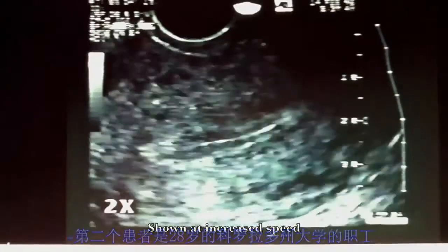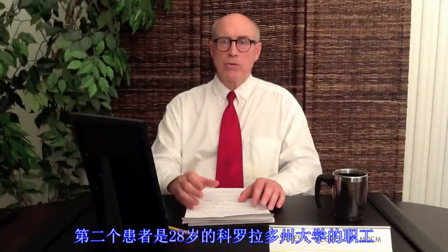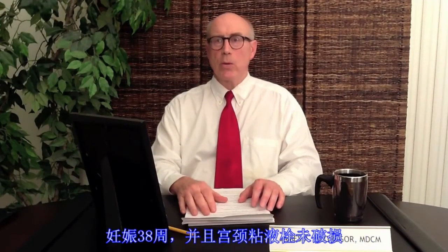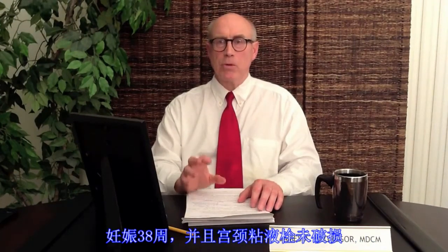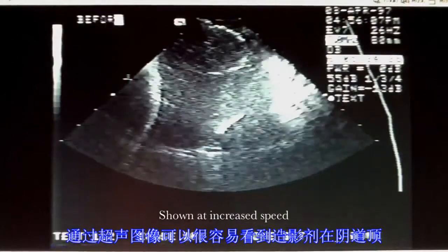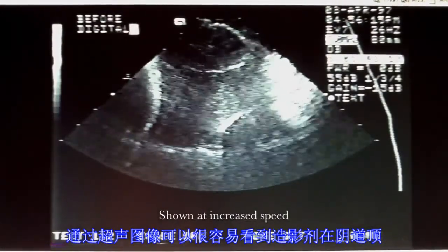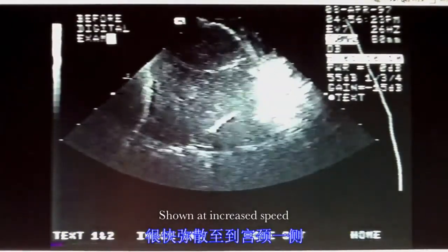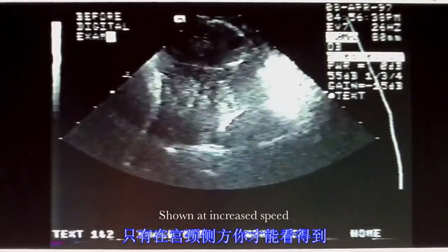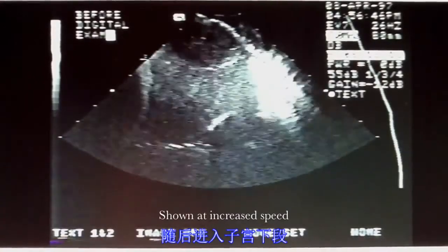In the second patient, who's a 28-year-old colleague of ours at the University of Colorado, she's 38 weeks pregnant and has an intact mucus plug, and she's having some uterine activity but not labor. But clearly there's no rupture of membranes, and the mucus plug is intact. You can readily see the ultrasound contrast media in the top of the vagina, and then within moments it goes up the side of the cervix, where you can see it on the side of the cervix, and enters the lower uterine segment.